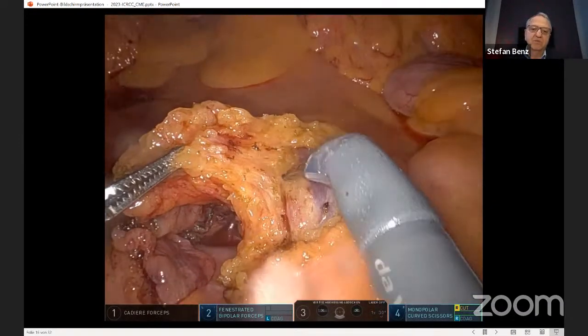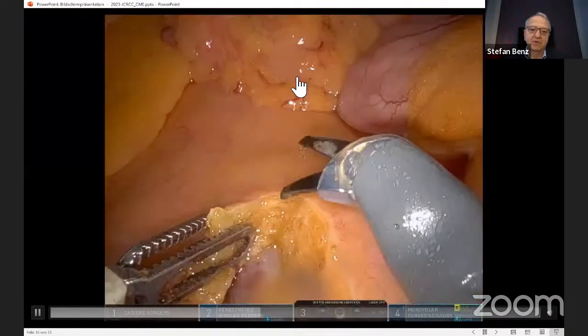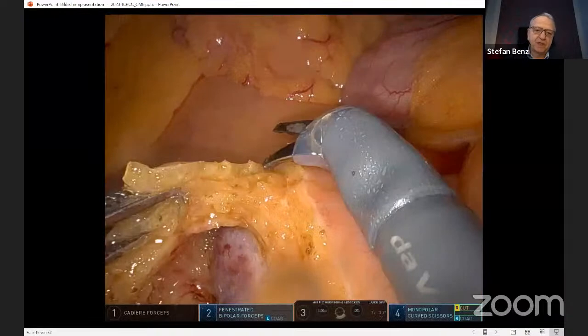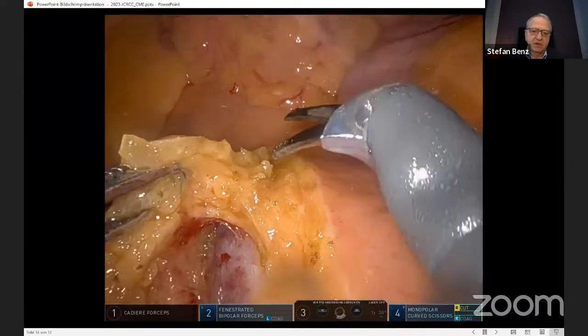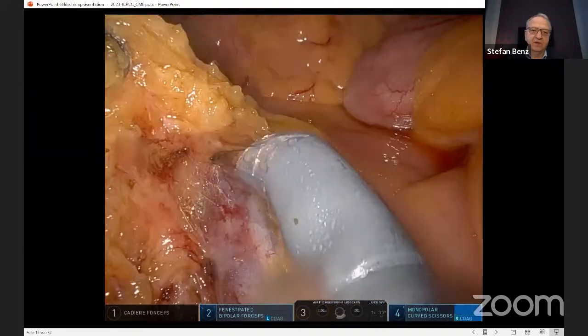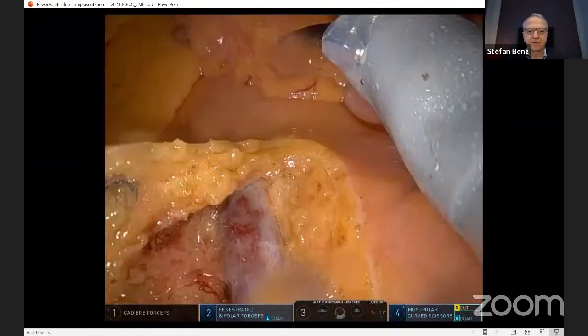And then you more or less just follow the way up until you reach the base of the mesocolon, respectively the ileocolic vessels. So this is dissected away, and then we encounter the vessels.